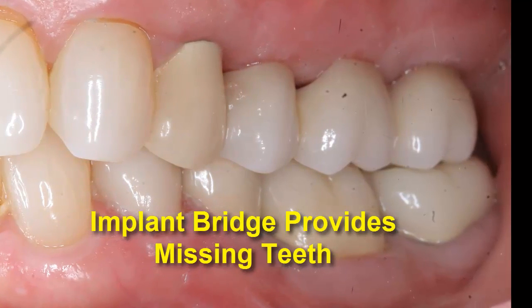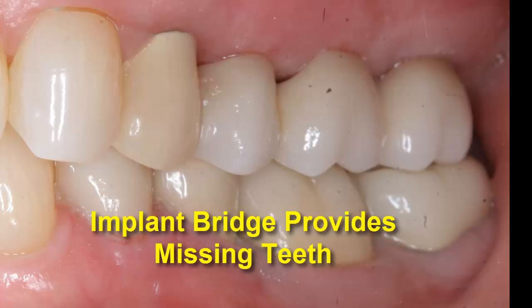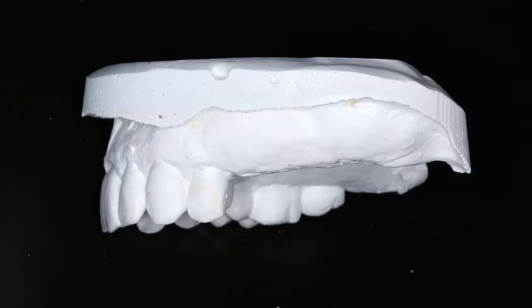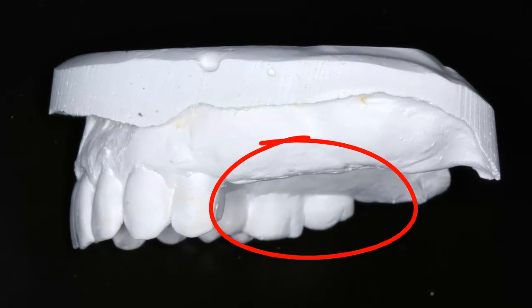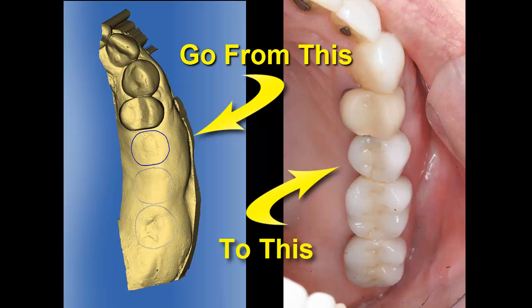Sirona and Galileos technologies provide confidence to achieve a predictable outcome for replacement of a missing tooth segment. So if you are self-conscious about gaps in your smile or black spaces in the back of your mouth that force you to overuse your front teeth, consider the precision of the processes shown here for your circumstance.